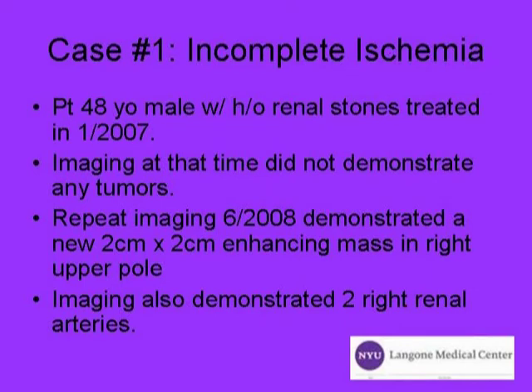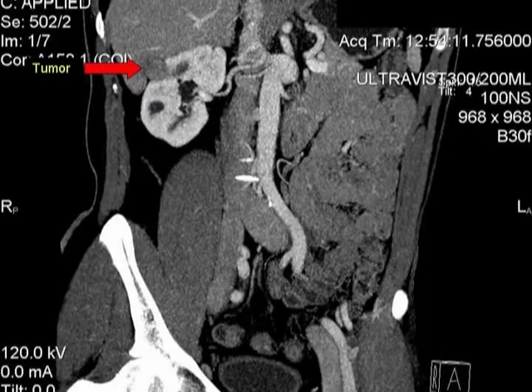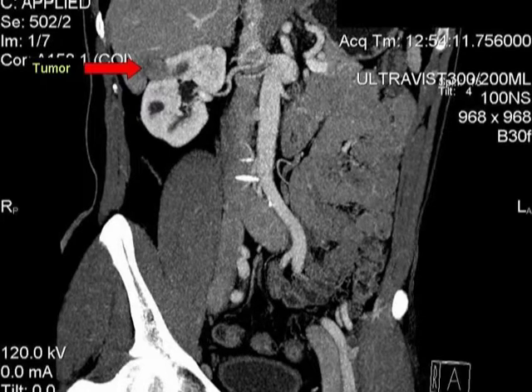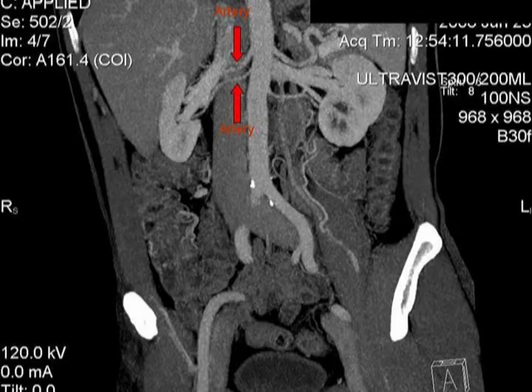Case 1: Incomplete Ischemia. The patient is a 48-year-old male with a history of renal stones treated in 2007. Imaging at that time did not reveal any tumors. In 2008, repeat imaging demonstrated a 2cm x 2cm right upper pole tumor. Of note, there are two right renal arteries.